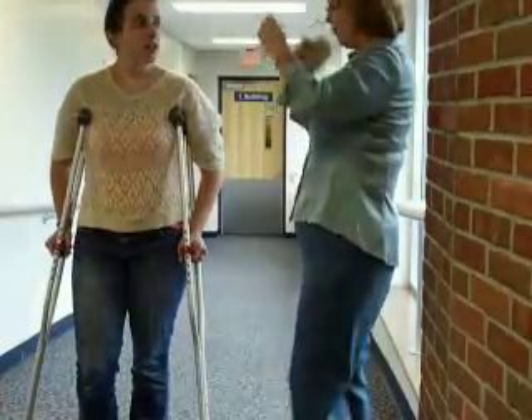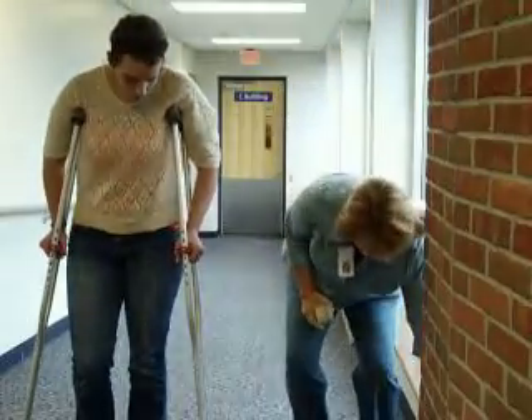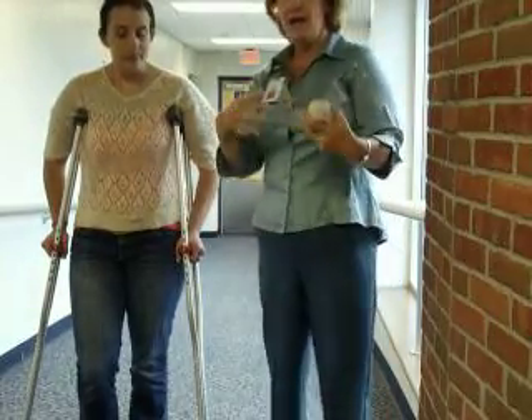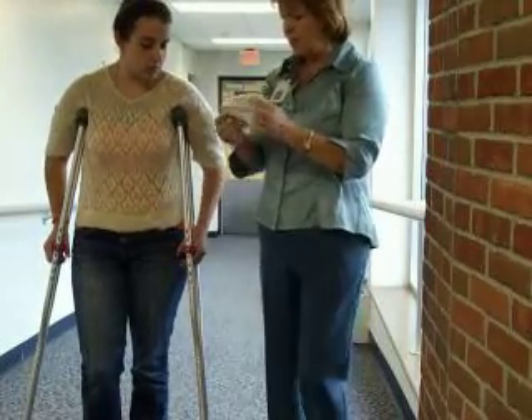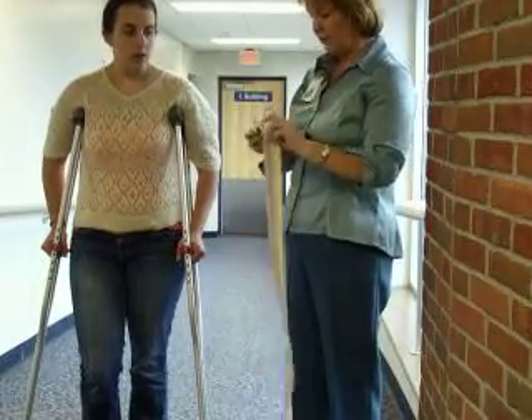Hi Sarah, my name is BJ Simmons. I'm from physical therapy and we are going to be working on the ramp here. I know that you are non-weight bearing on your right side. I would normally have the patient sitting in the wheelchair but it would be in the way for this video, so I'm not going to have the wheelchair here. I'm going to go ahead and put this gait belt on you to keep you safe while I help you on the ramp.